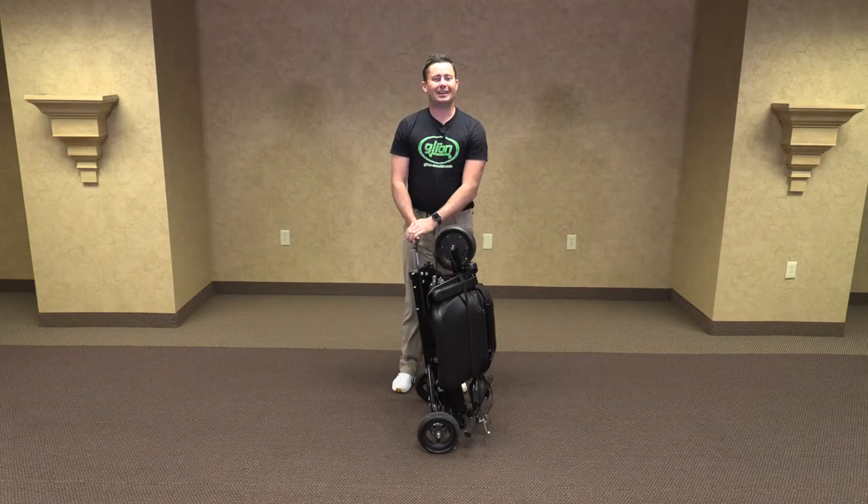Thank you for purchasing your new Glion Snap N Go Model 335. Welcome to our operational video. Let's get started.